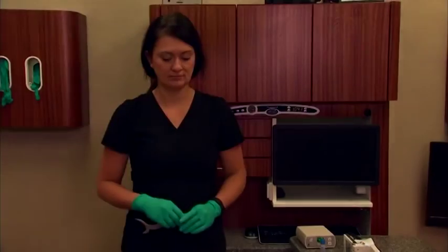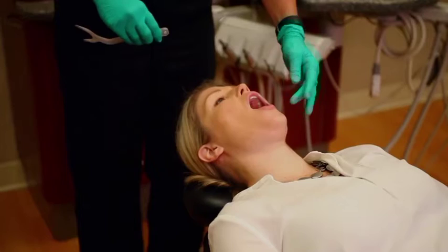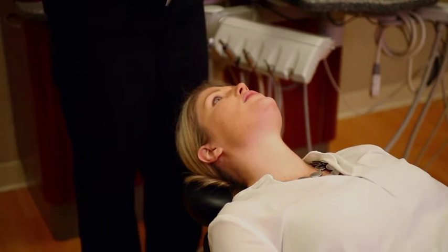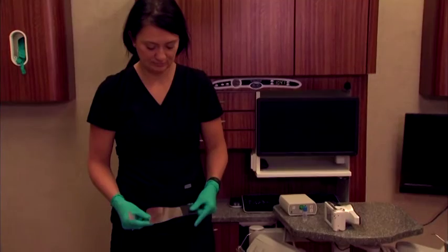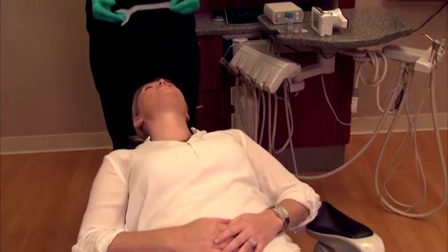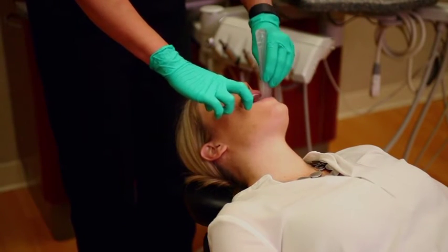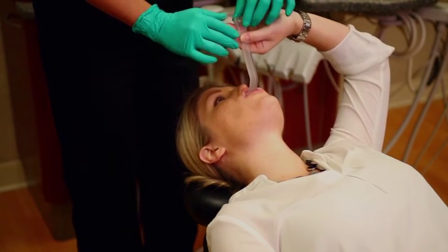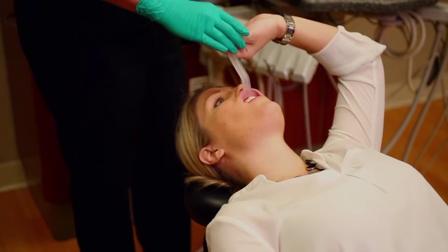Before we get going, I want you to look at the setup. We're going to have a mirror — the ones that are really nice are the ones that have some sort of handle on it that you can grab hold of. We also have a very specific retractor that is designed to simply pull the upper lip away from where we're trying to go, so the upper lip just gets nicely retracted out of the way, and the patient can easily hold this.